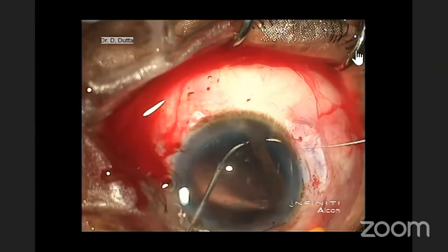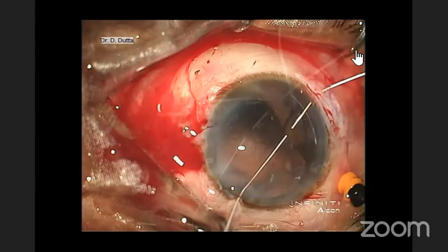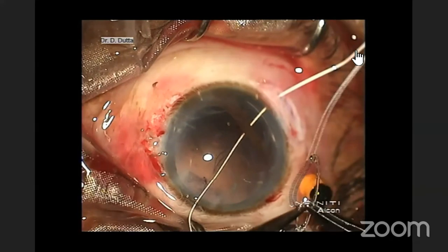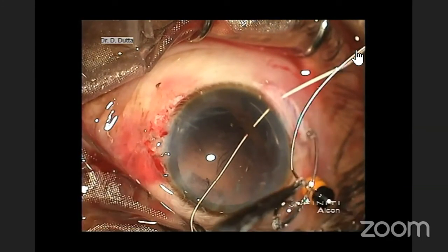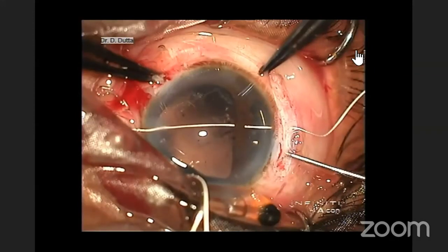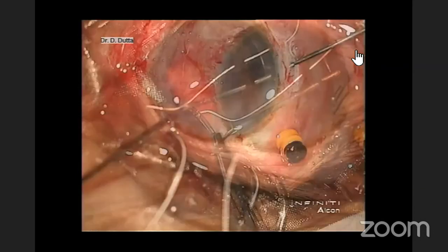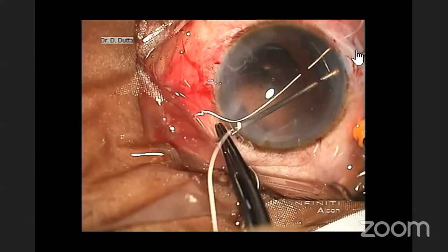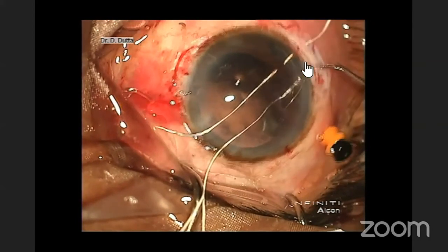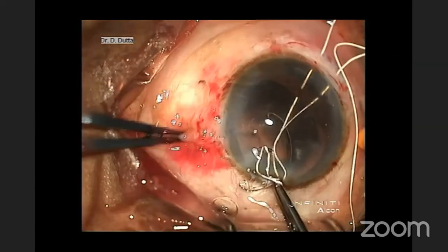We enter with the needle through the sclera at the junction of 1/3 and 2/3 of the area of dialysis, pass through the outer edge of the torn iris, and bring it out of the eye through the pupil by railroad technique. The eye of the emerged segment is threaded by Gore-Tex suture. Now we do a similar pass through, this time by a hollow 26 gauge needle. The needle is docked and brought out through the bed of the Hoffman pocket. The capsular segment is now placed in the bag.